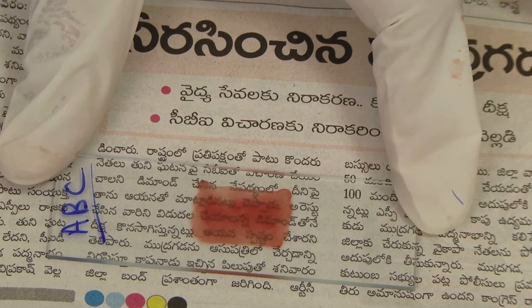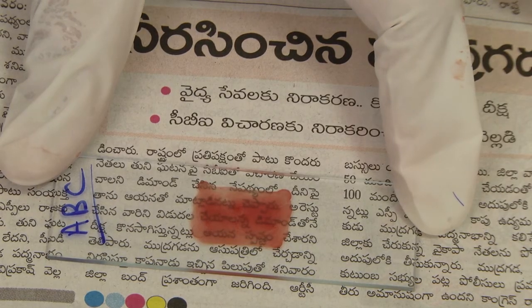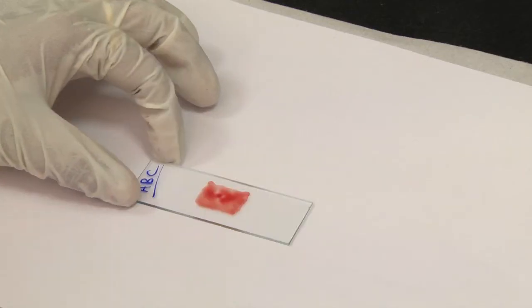Correct thickness is attained when newsprint is barely legible through the smear. Lay the slides flat and allow the smears to dry thoroughly. Protect the slides from dust and insects. Insufficiently dried smears and smears that are too thick can detach from the slides during staining. Protect thick smears from hot environments.